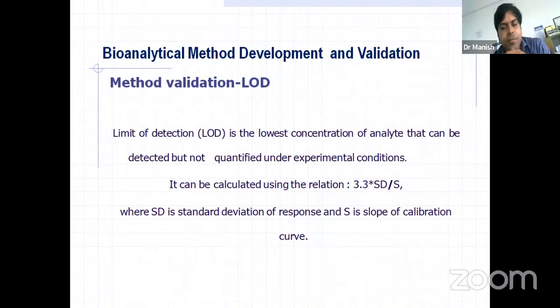So accuracy studies, I said, minimum for performing analysis require five concentrations, which have been prepared in triplicates, and we are going to divide the day into 3, that is morning, afternoon, and evening, and we are going to average the morning 3 triplicates data, afternoon 3 triplicates data, and evening 3 triplicates data, and we are going to construct the calibration curve by taking the average of the 3.